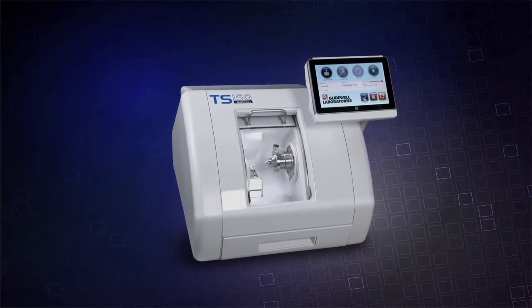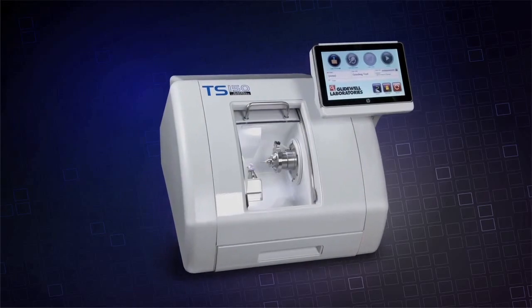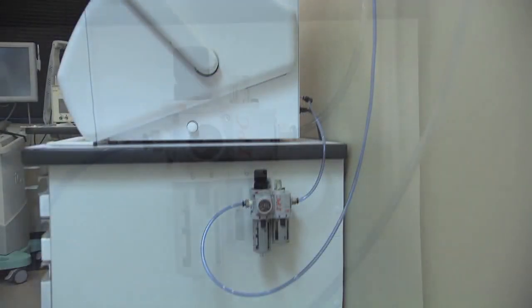In this chapter, we will cover milling the restoration with the TS-150 in-office mill. Before starting the milling process, there are a number of service checks that should be performed.